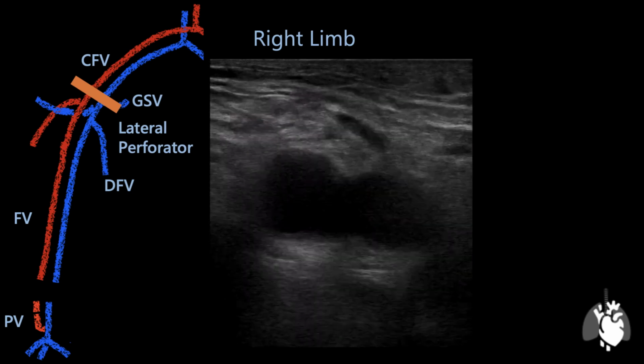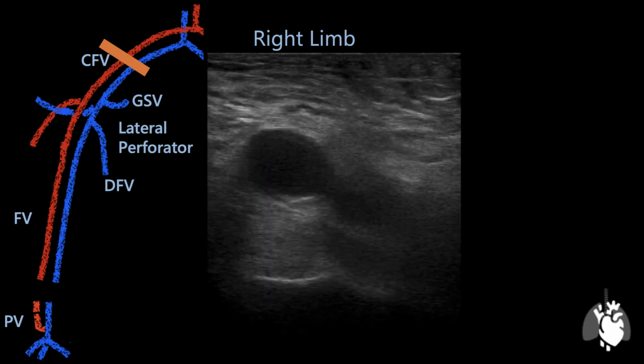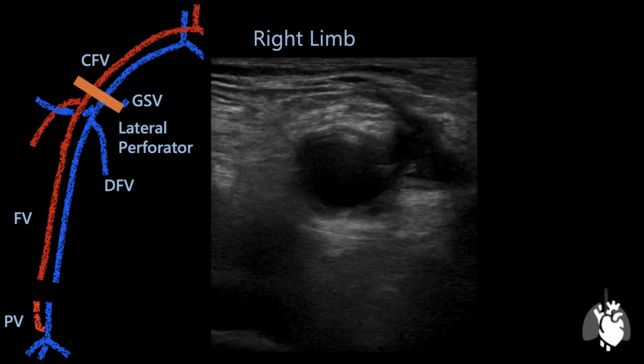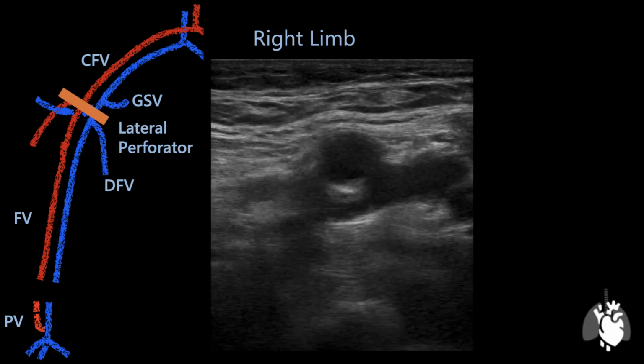As we move the probe more proximal, we find the common femoral vein, and somewhere in here it will transition to the external iliac vein. Remember, they only differ based on the landmark of the inguinal ligament. Skipping a few steps, we would compress all the way down the common femoral vein until we get to this junction, and very carefully ensure the complete collapsibility.